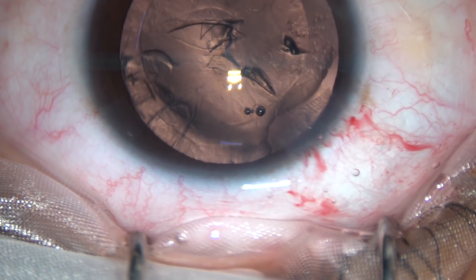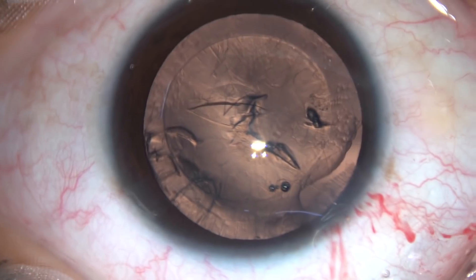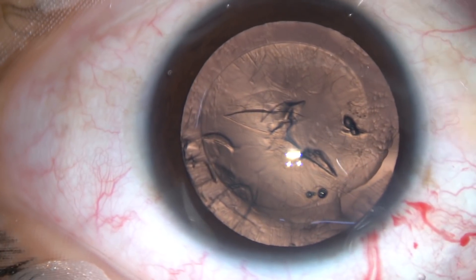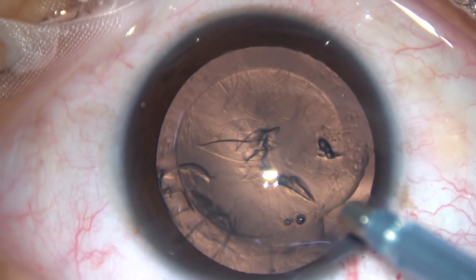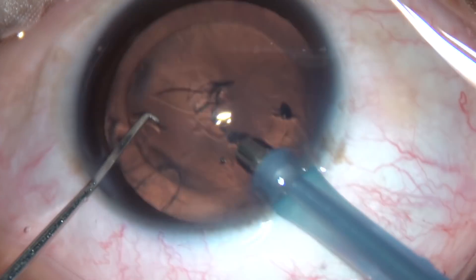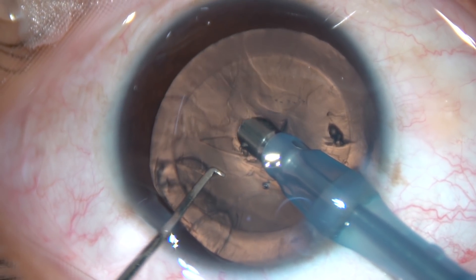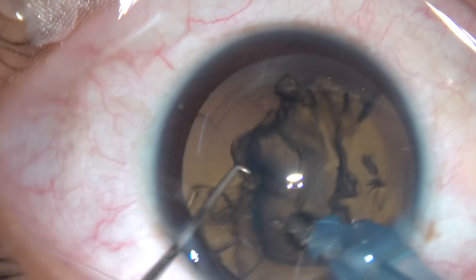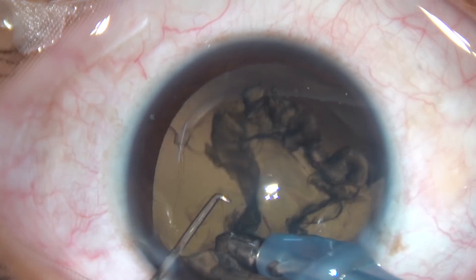Some more viscoelastic is added anteriorly. This is what I call phaco aspiration — just keep the tip of the phaco handpiece towards the nuclear mass, towards the lens mass, and use only vacuum. Use only vacuum and see what happens — the whole nuclear mass, the lens mass, comes off.